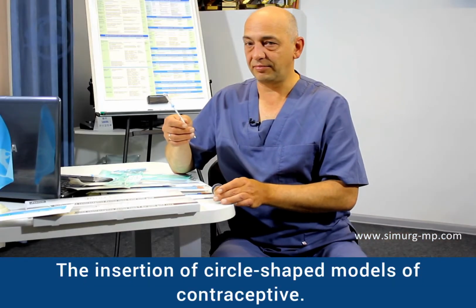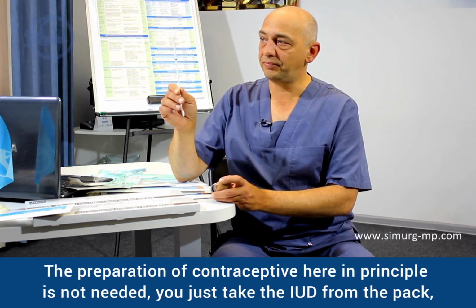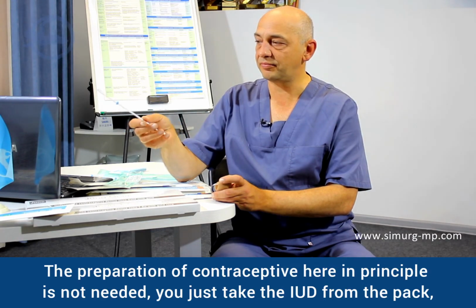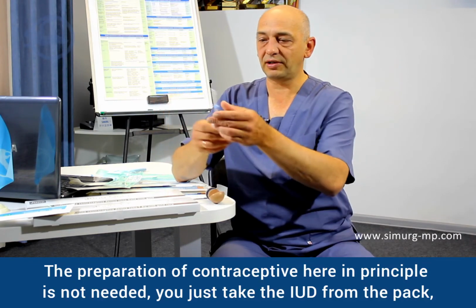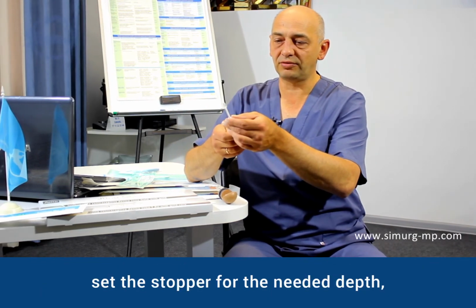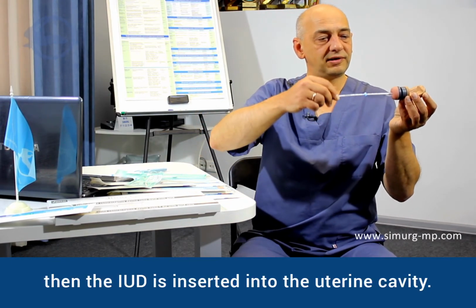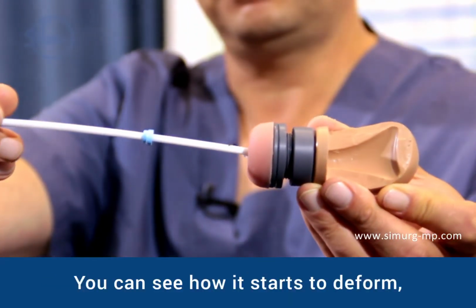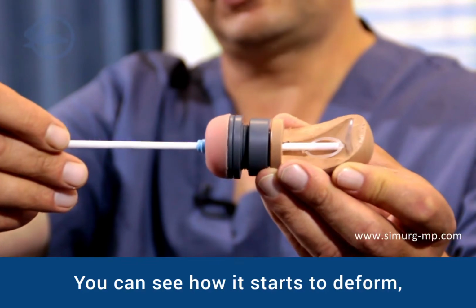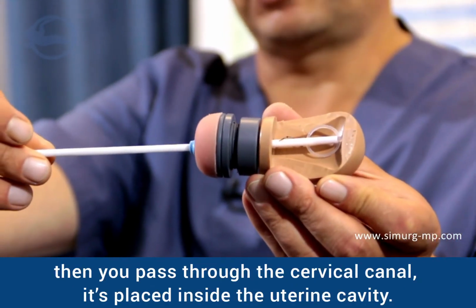The insertion of circle-shaped models of contraceptive. The preparation of the contraceptive here in principle is not needed. You just take the IUD from its packaging, set the stopper for the needed depth, then the IUD is inserted into the uterine cavity. You can see how it starts to deform. Then you pass through the cervical canal. It's placed inside the uterine cavity.